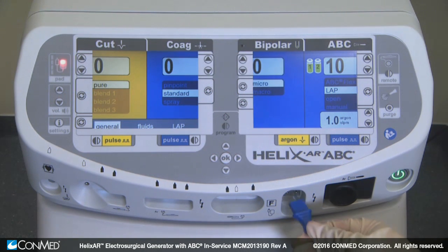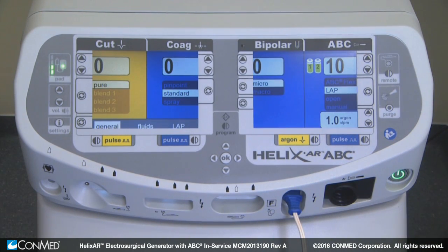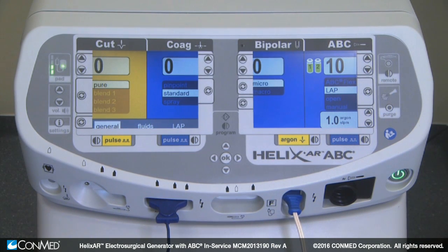When a dual-foil dispersive electrode is applied to the patient and connected to the generator, the indicator flashes green and the contact quality bar illuminates between one to four bars based on quality of electrode contact. Once a monopolar device is successfully activated, the pad indicator will turn steady green and the contact quality bar will illuminate all four bars. If the quality of contact deteriorates, bars will be extinguished.